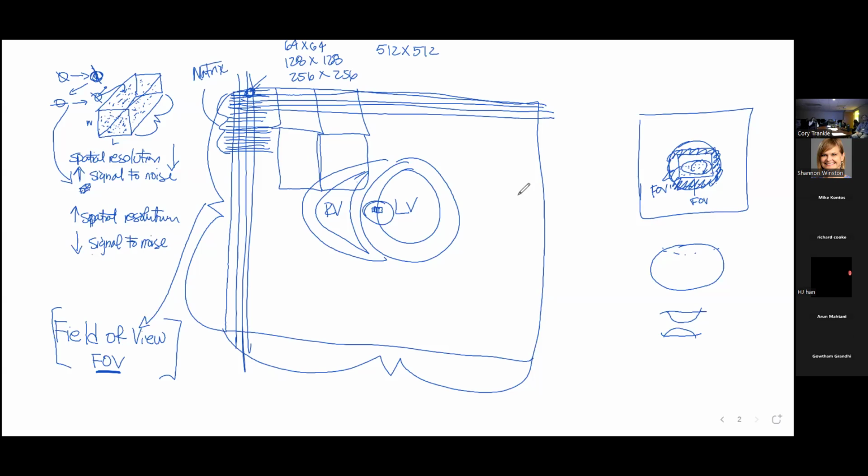And that's important for this purpose over here, the high spatial resolution and the low spatial resolution. So for high spatial resolution, we might have a field of view, typically in a normal-sized person, of say 30 centimeters. That's this total distance. And then we might stick in there, I don't know, 256 lines to make the pixels, so that we get the resolution that we need for the target that we're interested to image.